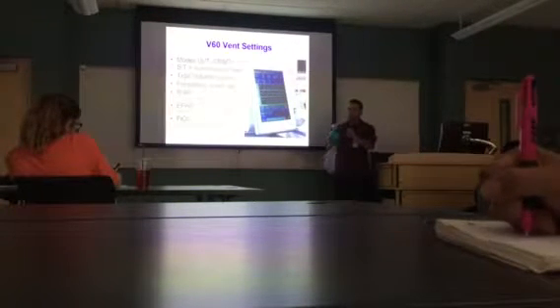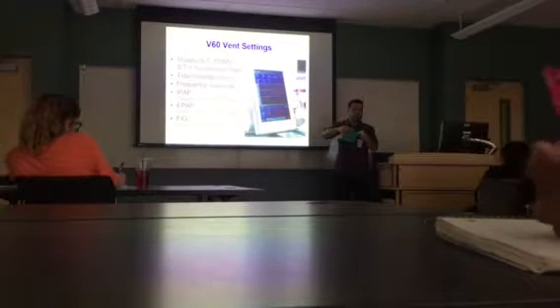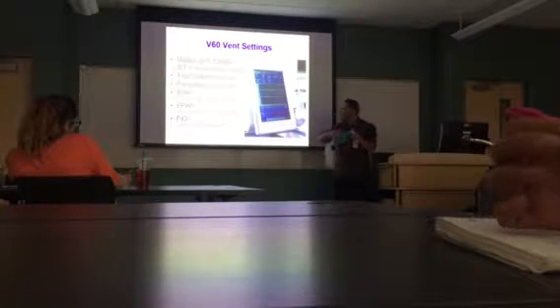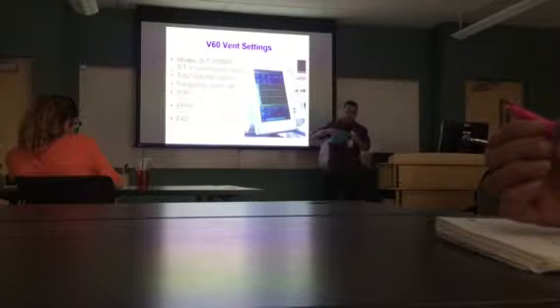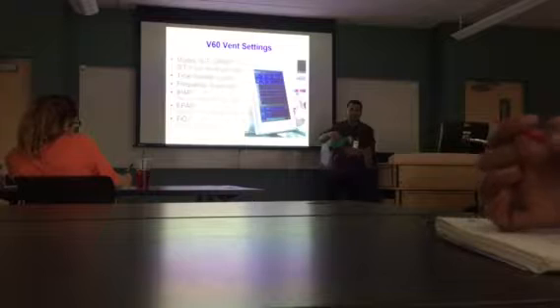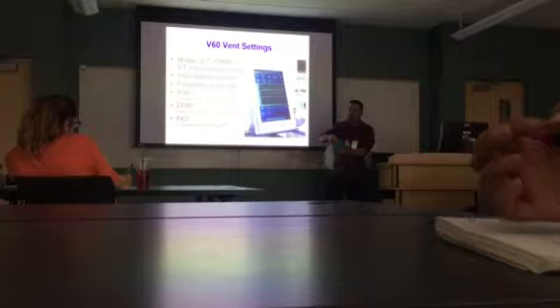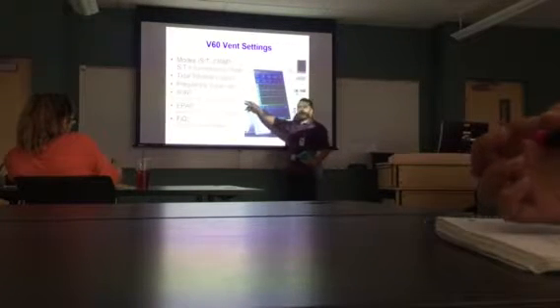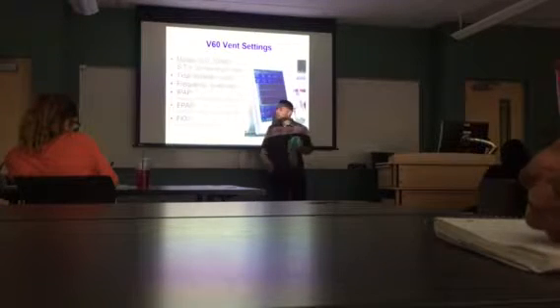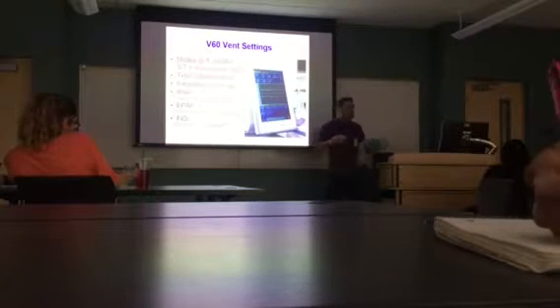IPAP is equivalent to if you were helping a person breathe with this type of mask and you squeeze it. That's IPAP. If I want to squeeze them, let's just say this is 7, just like that. If my squeezing the bag at a pressure of 7 is not sufficient for the patient and their chest is barely rising, then I'm going to do 14. I'm going to give them a higher pressure. So the amount of IPAP is going to determine how much tidal volume, how much you're pushing into the patient's lungs. EPAP is just that pressure that's left in the lungs at the end of exhalation.